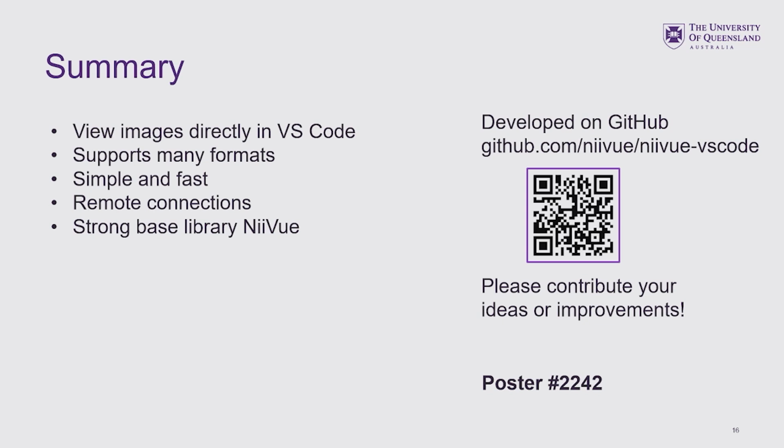We have one more quick question. Can I visualize fMRI-based correlations for a voxel? That's a no, because at the moment it's just a viewer, so it doesn't have any underlying computations going on. That could be a new project to create more capabilities. At the moment, it just is a plain viewer. So correlations, if they are in image format, I'm not exactly familiar with how these correlations are made. If they are in images, the image can be viewed, but if it needs a calculation, it's not done at the moment.